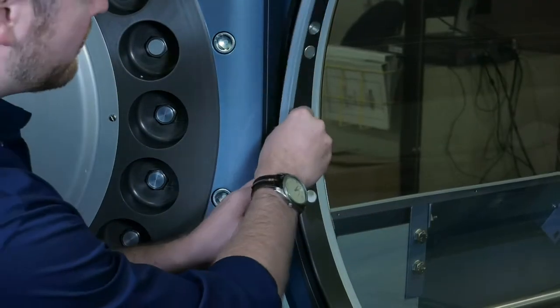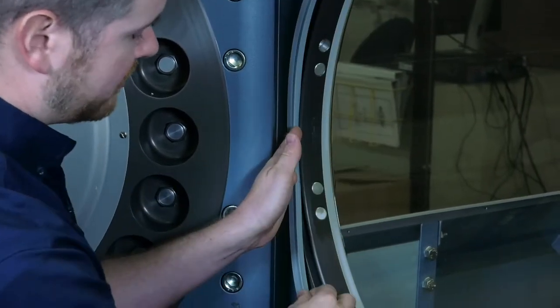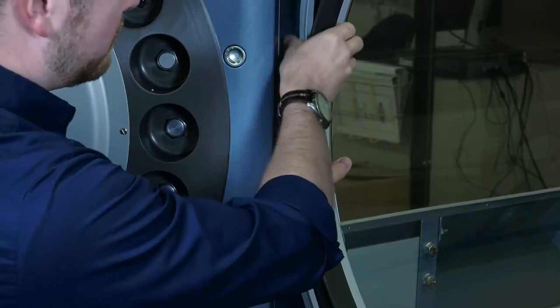Then you're going to come over to the 9 o'clock position. Just like at the 3 o'clock, you're going to make sure you have an even amount of door seal on the top and the bottom, and you're going to push the door seal in at the 9 o'clock position.